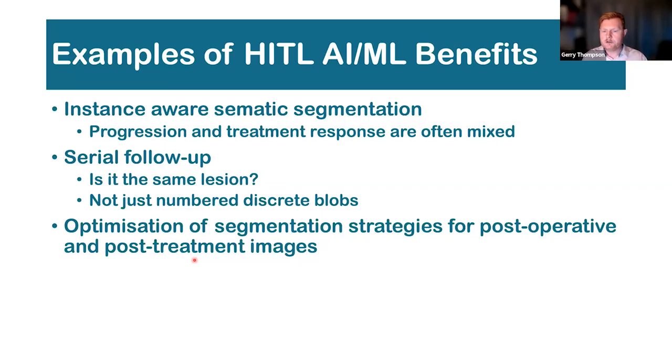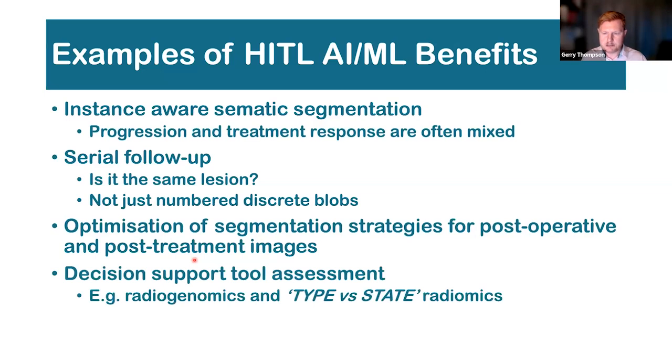And also, as I mentioned, optimization of those strategies for the post-operative and post-treatment images, where there may be unexpected features like hemorrhage, swelling, post-surgical diffusion change and restriction along the resection bed, resulting in an enhancement that's not tumour-related. And this is a really useful decision support tool assessment.